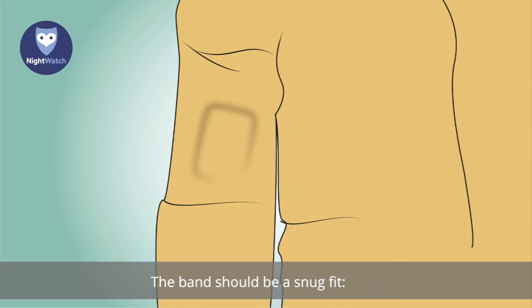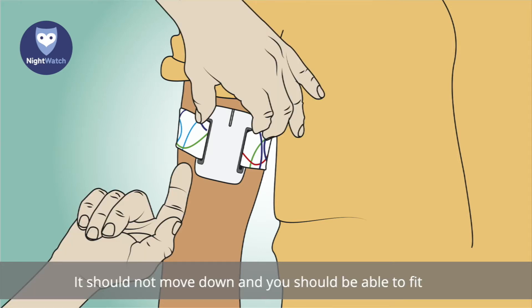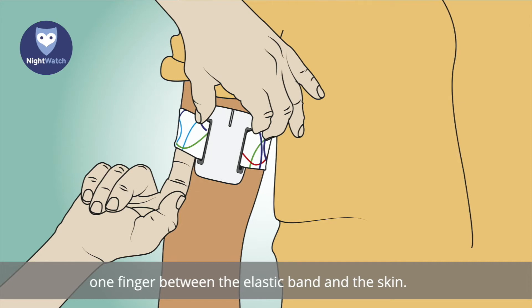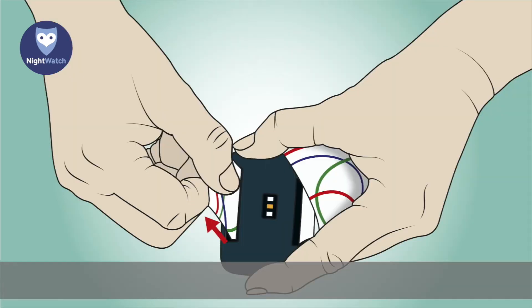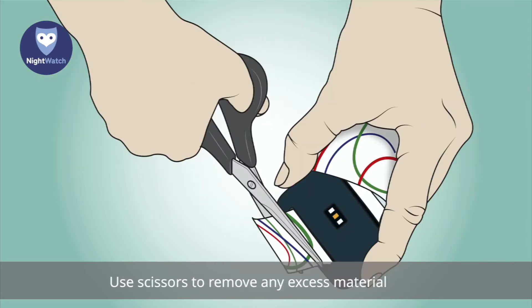To check that the armband fits properly, wear the arm module on the front of the upper arm around the biceps directly on the skin. The band should be a snug fit — not too tight and not too loose. It should not move down, and you should be able to fit one finger between the elastic band and the skin. Adjust the band by pulling the material and use scissors to remove any excess material on the inside of the arm module.